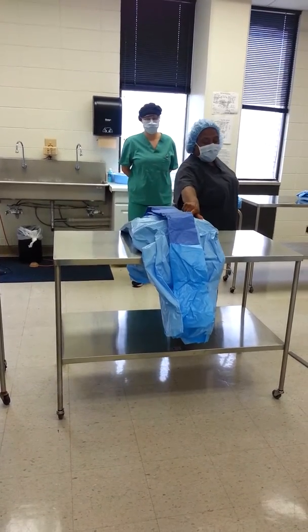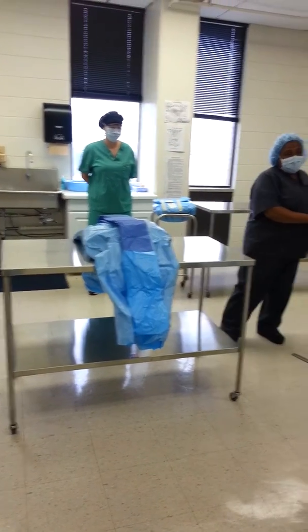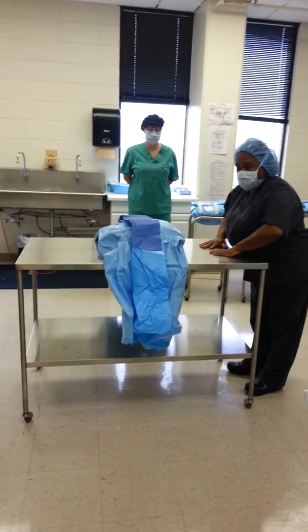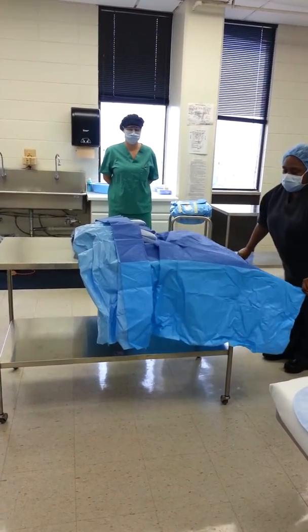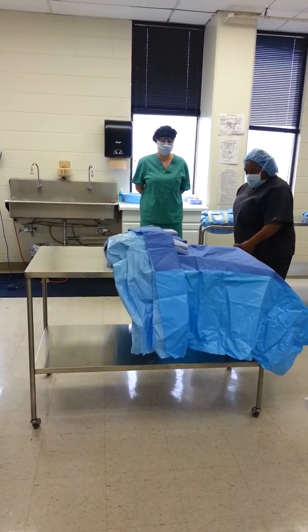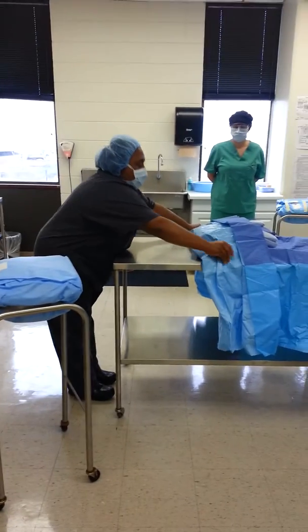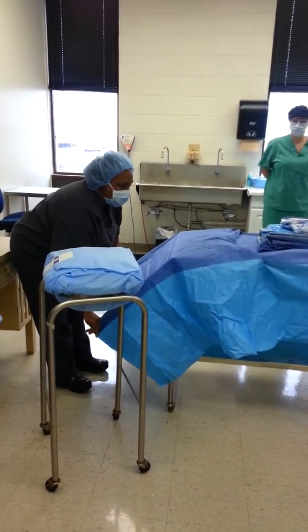And then you see this is the rough edge that's showing, so that's showing me that it comes to this side. I can move my mayo stand out of the way. I come all the way to the side, I grab, and I can lean on the table because there's no barrier here. I pinch, I pull down. I walk around to the other side, and I make sure I have that distance of a foot to 18 inches away. I can push this out of the way because it's not open. And pull down.